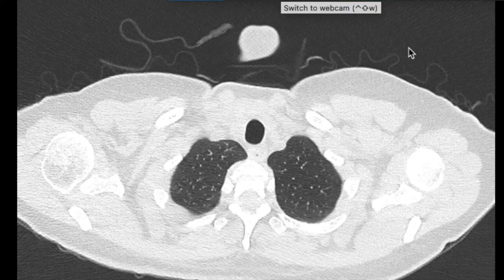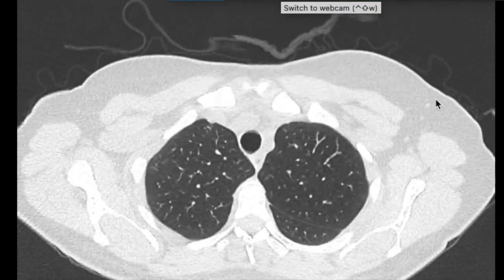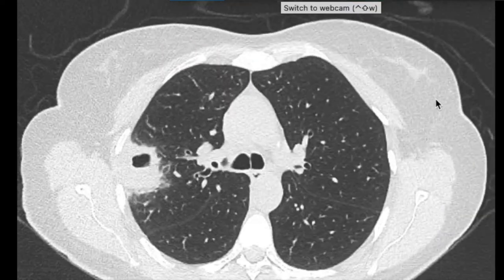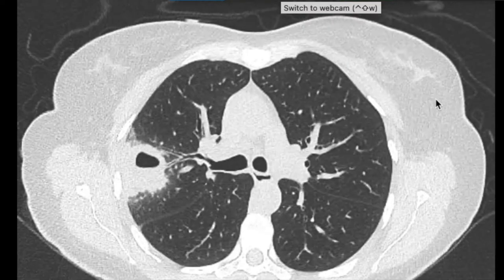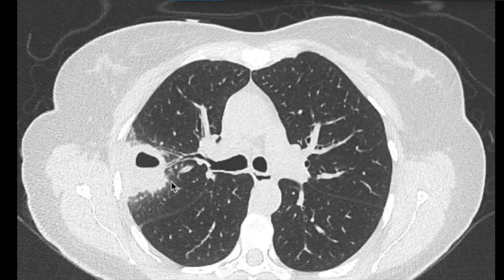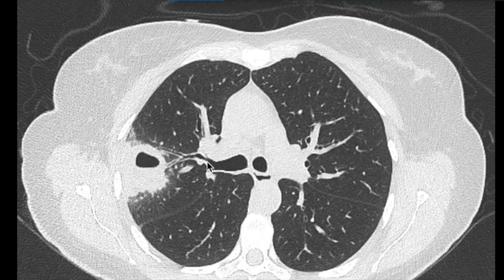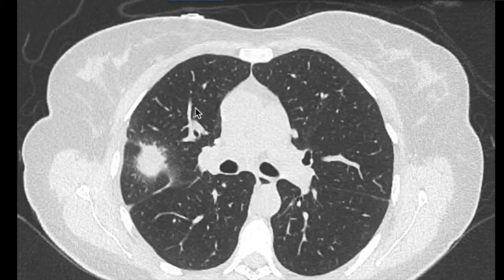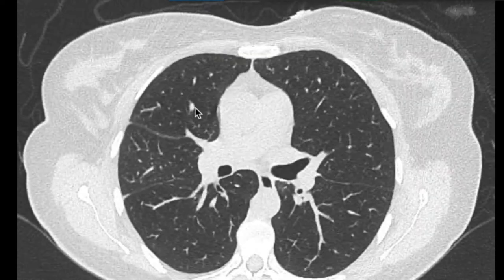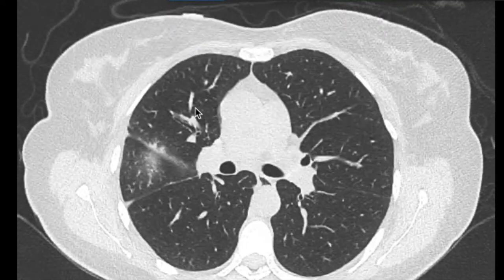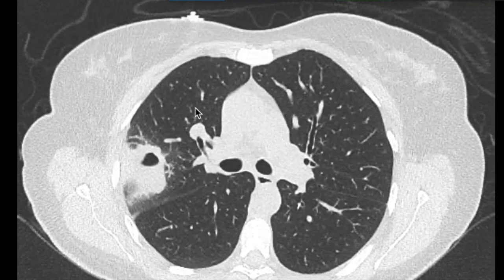I'll scroll through the CT for you now. These are the axial views and here's the cavity situated here. You can see that it's quite a thick-walled cavity. It may have an air-fluid level. There's a little bit of nodular change, possibly some ground glass surrounding it. It's situated in the right upper lobe, maybe crossing slightly into the right middle lobe.